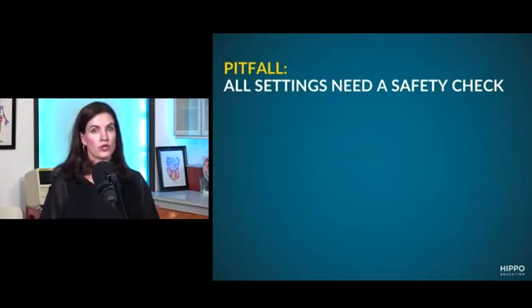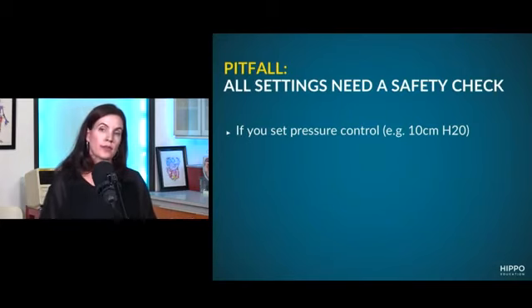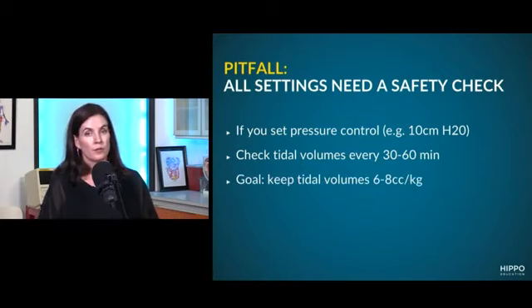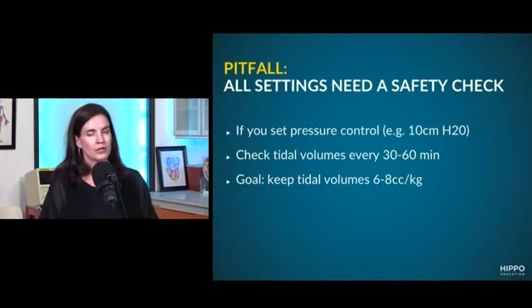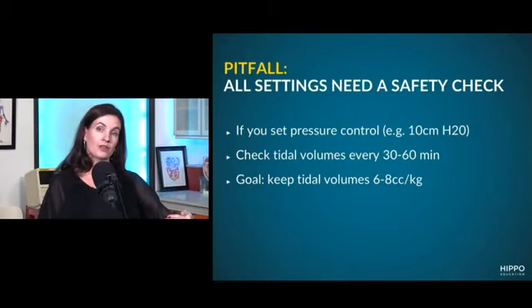So the converse situation is if you've set a pressure control instead, because maybe you work at a pressure control center, and that's fine. So if you want to start setting a pressure control, I usually start with 10 centimeters of water as your initial driving pressure. And then I want to check to make sure that the volumes are acceptable. And so I would have a look at the tidal volume and make sure I'm keeping them between 6 to 8 cc's per kilo. So no matter what you set, you need to have calculated your patient's ideal tidal volume, because you either are going to set that up front or you're going to use that in your safety check.